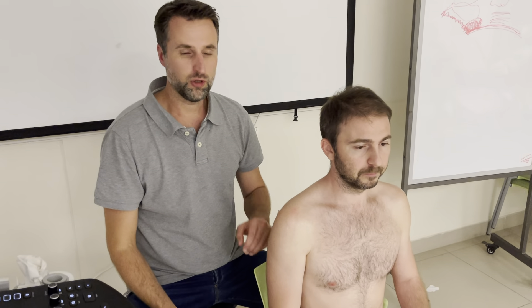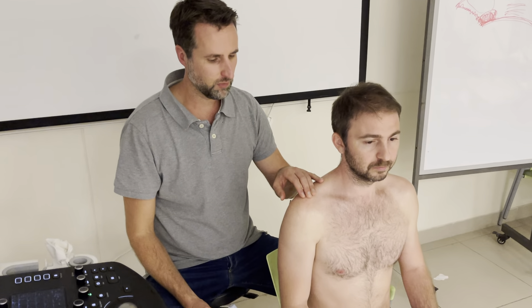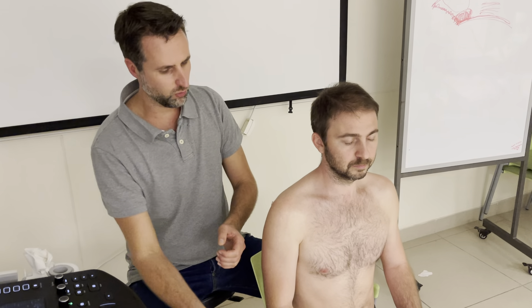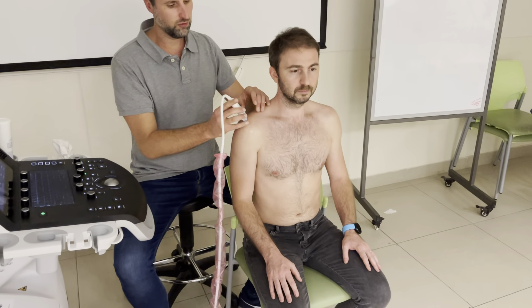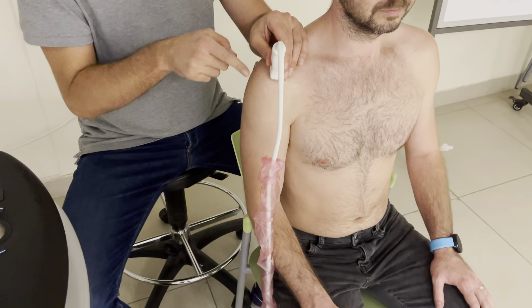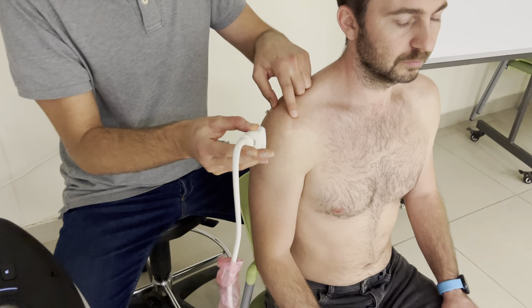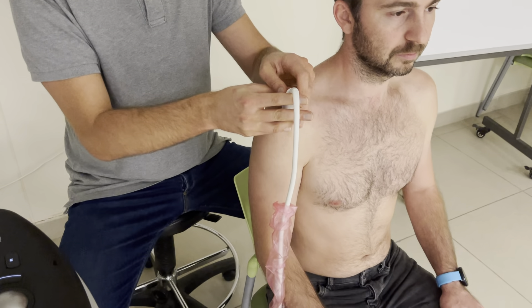We're going to make a dynamic view of the supraspinatus going under the acromion. We place the probe with the arm in neutral — it's a bit different from before when we had the arm in retroflexion, so the supraspinatus is going to be a bit more anteriorly. I place the probe here on the acromion, I can palpate it here, and distally it goes on the supraspinatus.